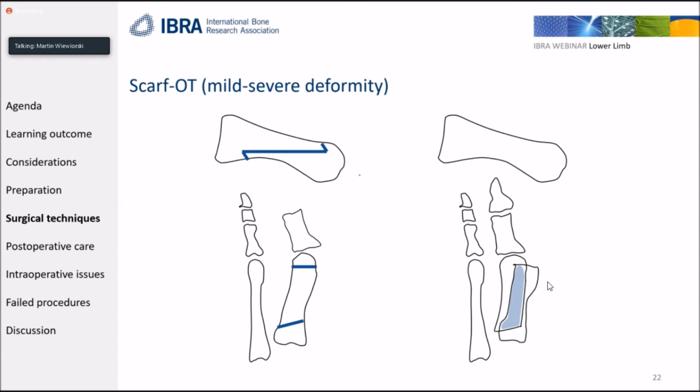So I think the good thing about this, if you look at the literature, many people complain that you cannot use this osteotomy to correct the IMA angle, for example. I think this is not true, because for one reason.